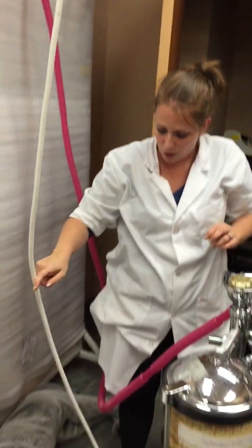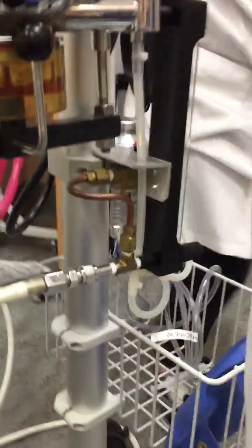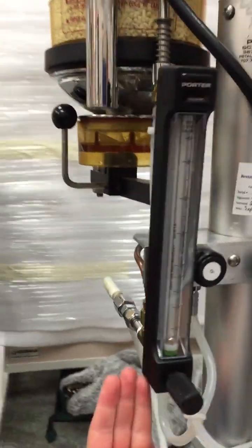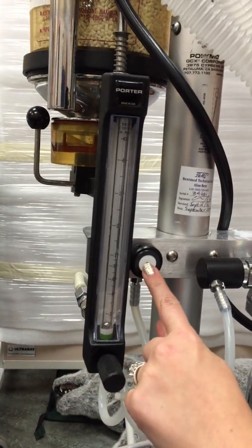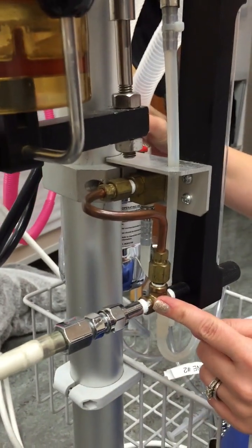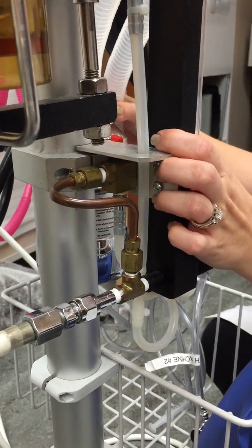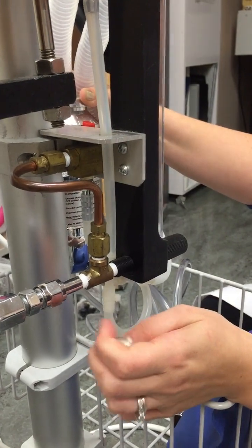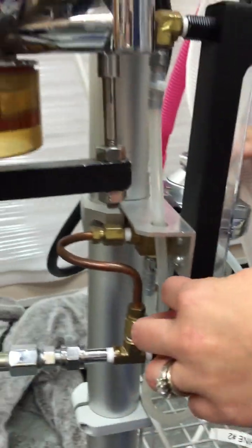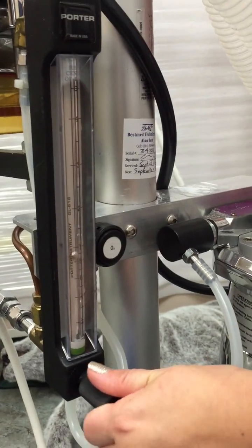From there, the oxygen is going to go through this hose right here towards our flow meter. So this is our flow meter right here, okay? And this is our oxygen flush valve. The oxygen is going to come from the oxygen hose, and it's going to go one of two ways. It's either going to make its way to the oxygen flush valve. When you push the button, it flushes the oxygen in, or it's going to come through this hose and up to the flow meter and into our flow meter when we turn that on.